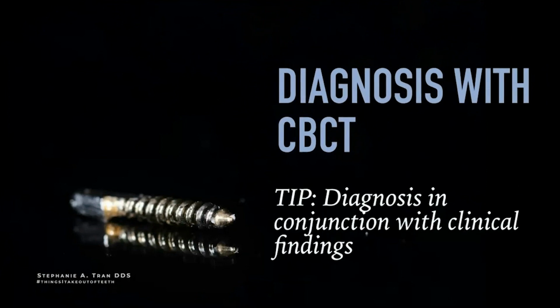Now, when we're making that diagnosis with a CBCT, another thing to keep in mind is that even the best machine in the world can only help you so much if you don't fully understand diagnosis clinically as well. So the main thing to keep in mind is that the diagnosis does need to be done in conjunction with clinical findings. One of the running jokes in a hospital, for example, is that the radiologist will often write at the bottom that they think certain things are found, but they always write at the bottom to be correlated with clinical findings. And why is that? Because a CBCT does not make a diagnosis in and of itself. We will need to put it in conjunction with clinical findings.